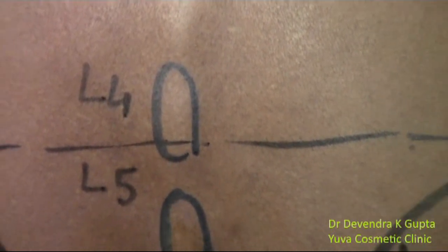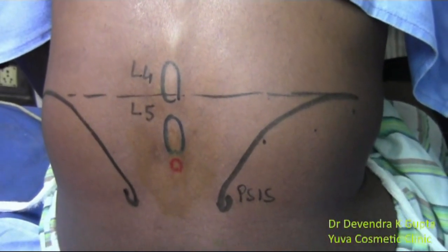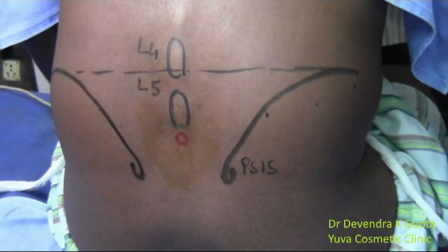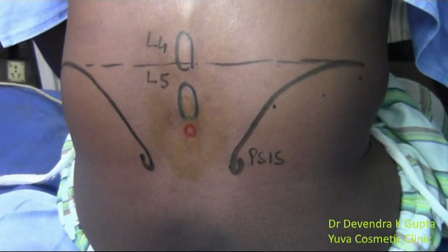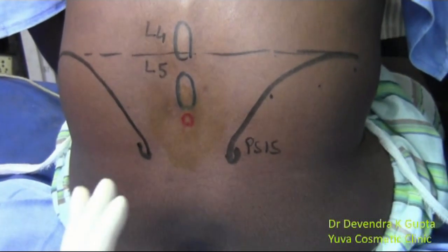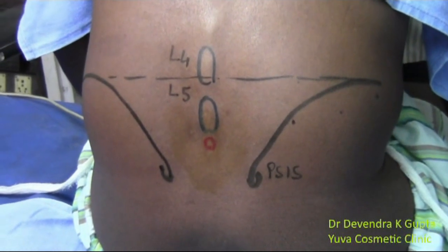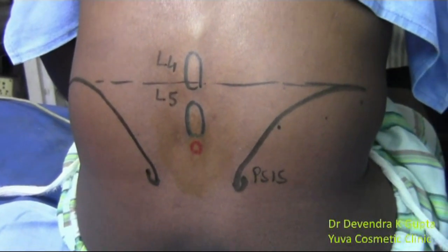He is a 40-year-old male patient with Fournier's gangrene of the scrotum and penis. I am giving the saddle block, which anesthetizes the genital area and the perineal area, but it doesn't block the sympathetic system. This makes it safe even for patients of extreme old age.